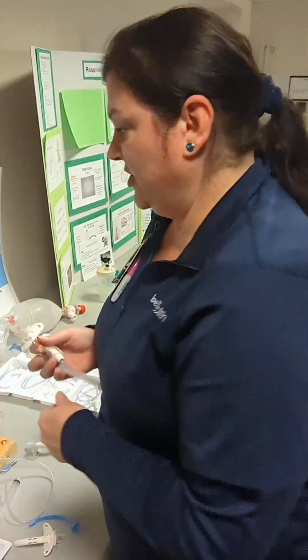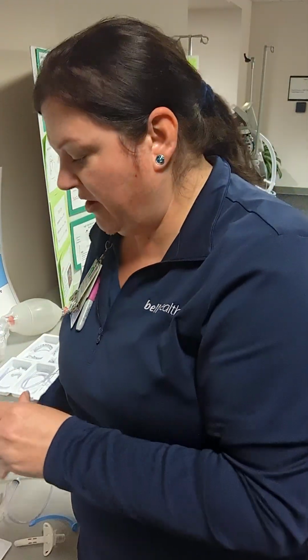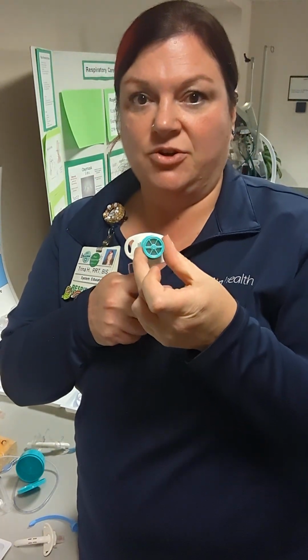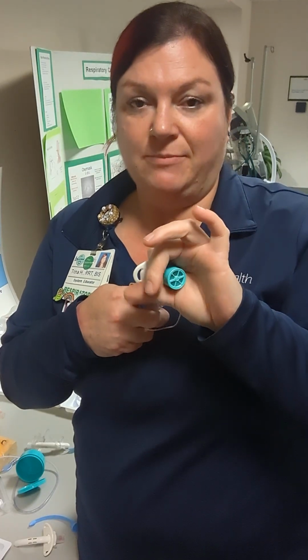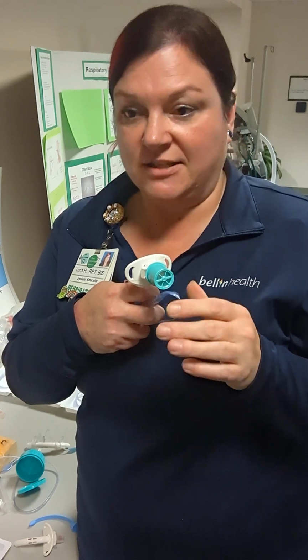If your patient has a Passy-Muir valve, which is a speaking valve, it looks like this, and it goes right on the end of the trach, like that. And if they're on a machine, that would be attached here. Otherwise, we can use the speaking valve just as is.